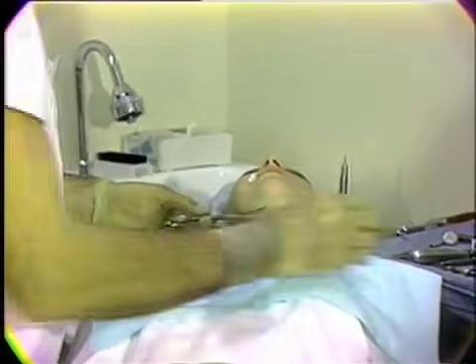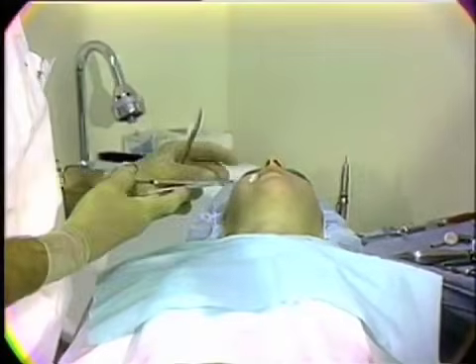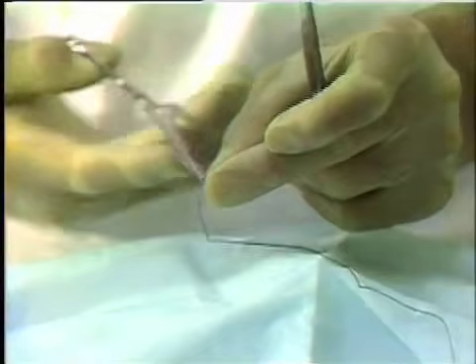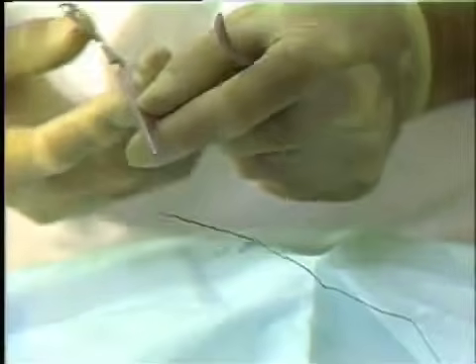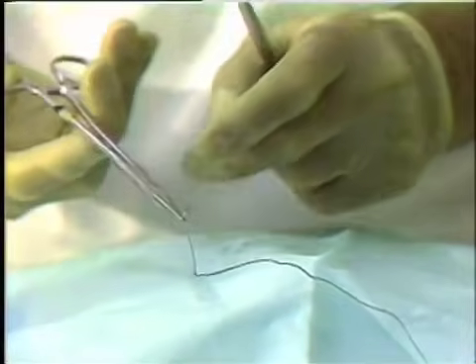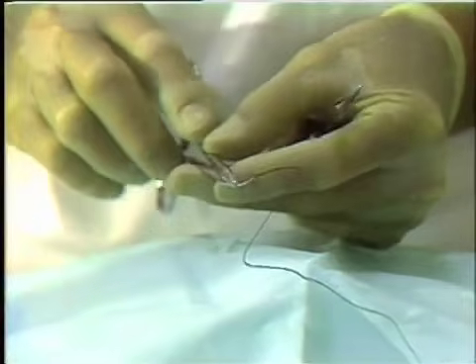The sutures are applied in a manner in which you've been previously instructed, utilizing 3/0 silk on this particular suture needle. The needle is grasped just with the tips of the needle holder, and that gives control to the needle point as it penetrates the tissue in this curved cutting needle.